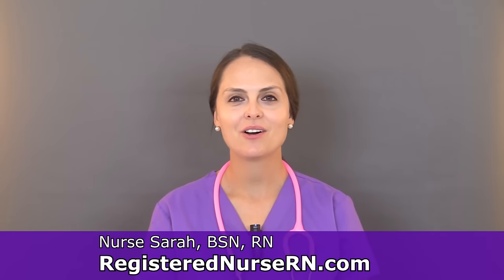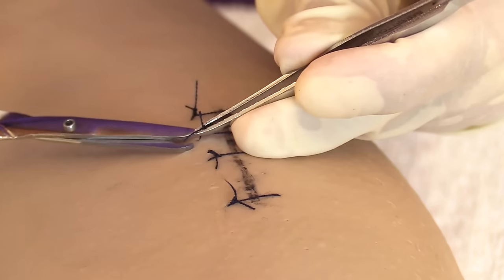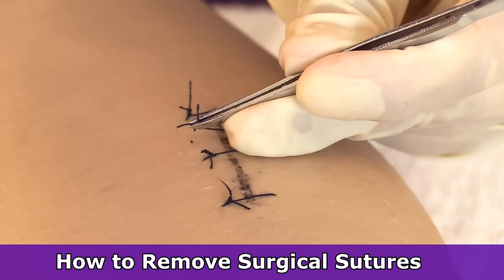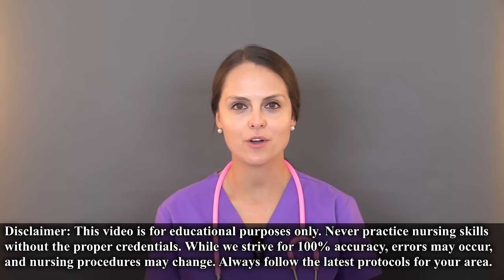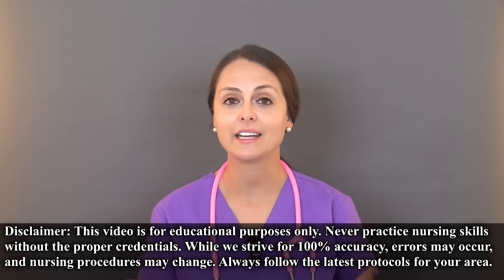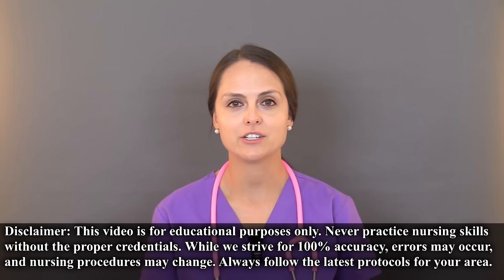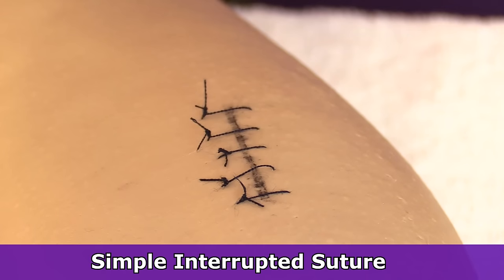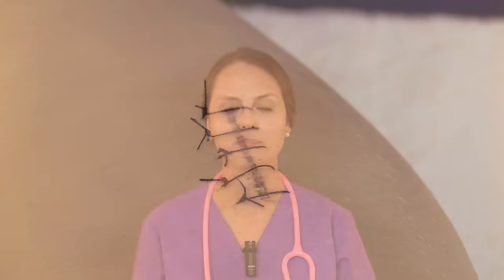This is Sarah with RegisteredNurse RN.com, and in this video I'm going to demonstrate how to remove surgical sutures — specifically simple interrupted sutures. Sutures, which are also called stitches, are used to close a wound that could have been sustained through an injury or a surgical procedure. There are various types of surgical patterns, and in this video I'm going to demonstrate how to remove the most common type, which is the simple interrupted suture.